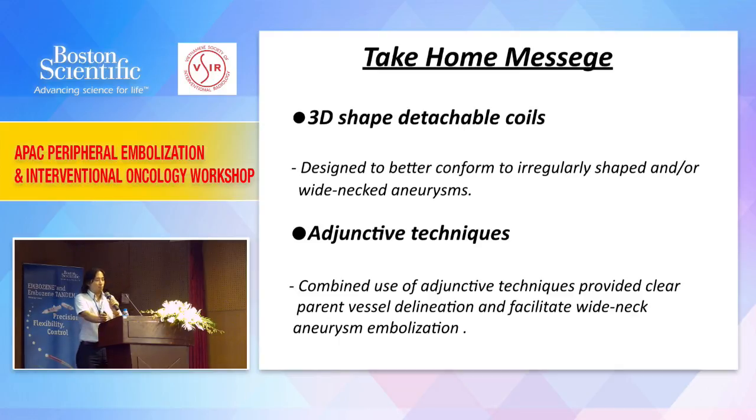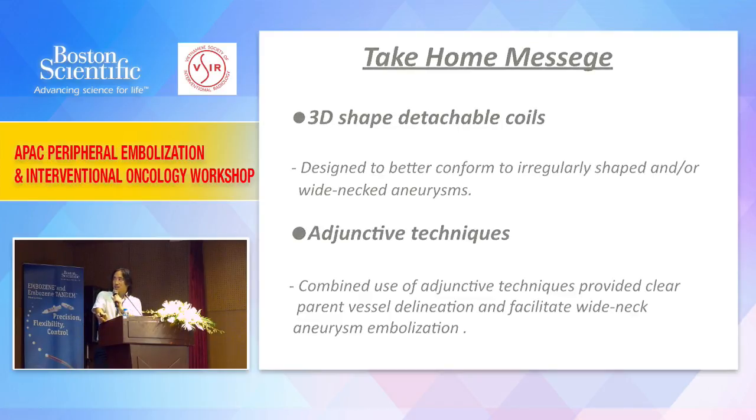Now also, the visceral arterial aneurysms are often very large and with a wide neck. So the adjunctive technique is essential. Thank you for your attention.